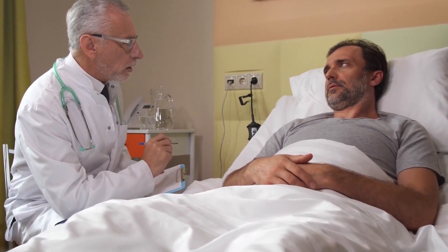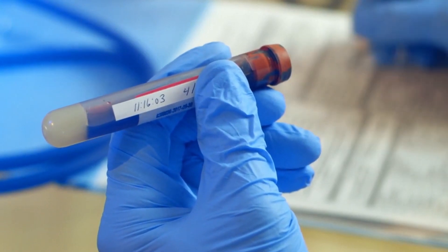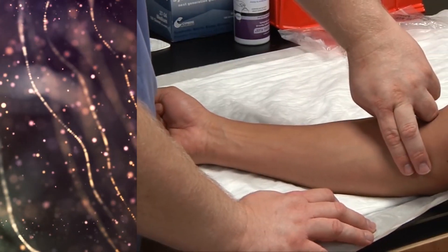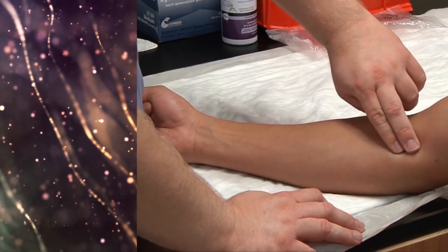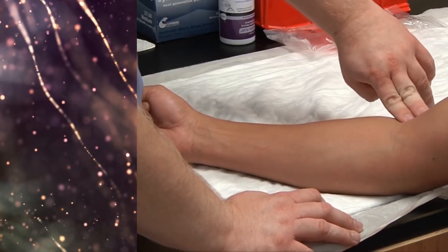Make sure the participant is sitting comfortably. Lay out all blood collection supplies and necessary labels. By visual inspection and palpation, examine both arms to find the best vein. Healthy veins feel soft and bouncy and will refill when depressed.